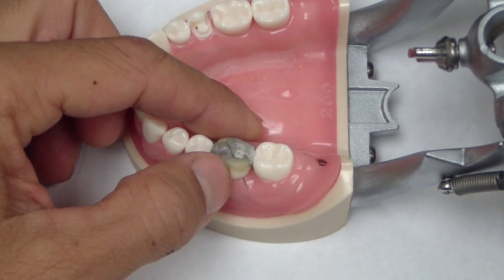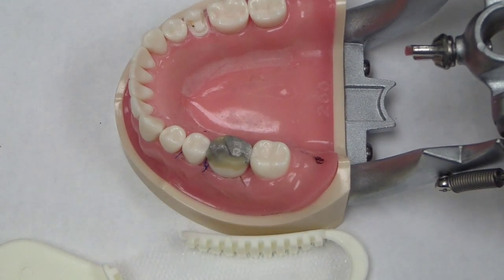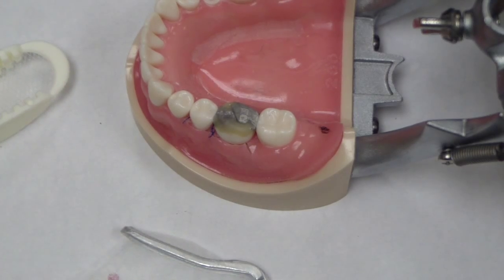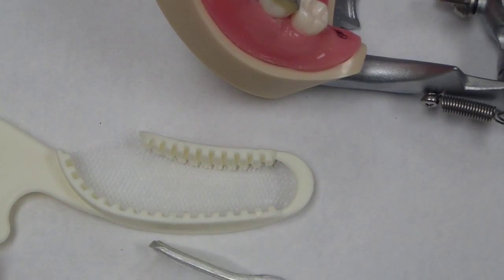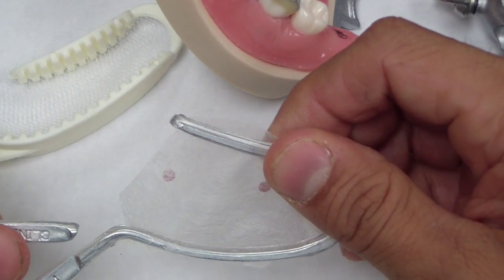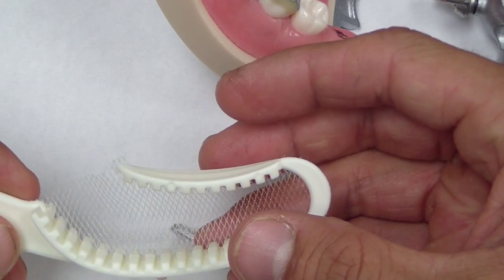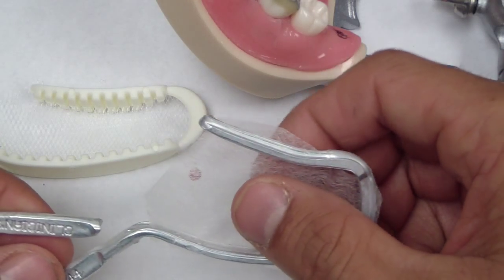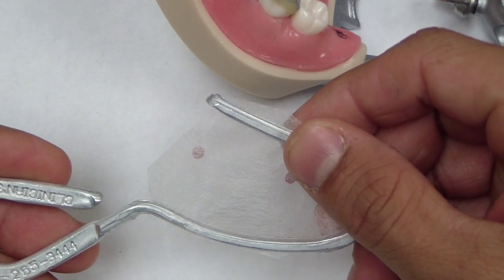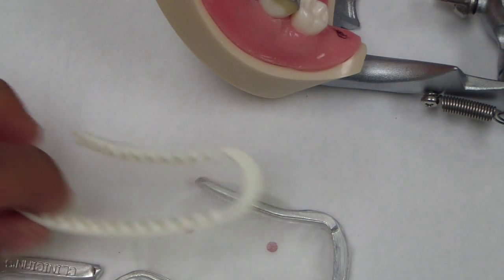Pouring up models kind of goes against doing this build-up intra-orally. Another way is using a triple tray. There's thousands of different products, and there's some literature — it's fairly controversial — about the flexibility of the plastic dual arch impression tray versus a more rigid one. Remember, the rigidity is the framework, and once you place material on it that may change the rigidity. I've reviewed some of the literature and I don't think there's a definitive right answer. We're going to go with the more rigid tray so the remainder of the impression will hopefully be more rigid than with a regular dual arch tray.